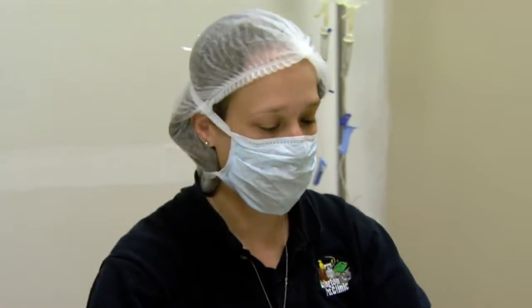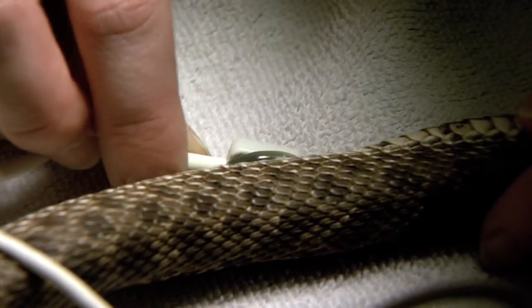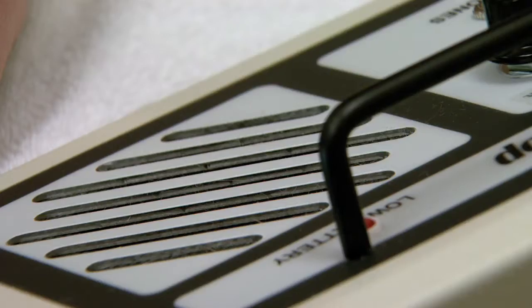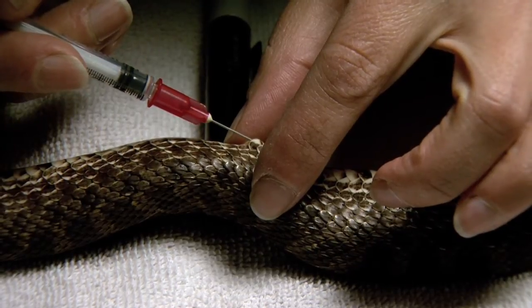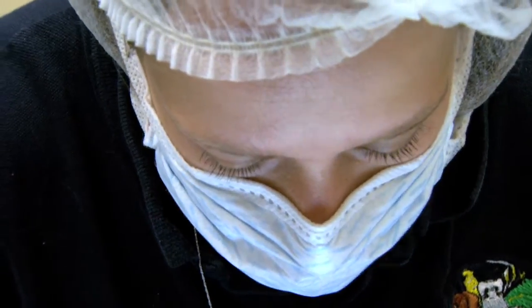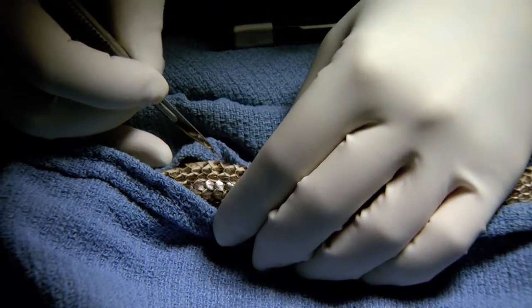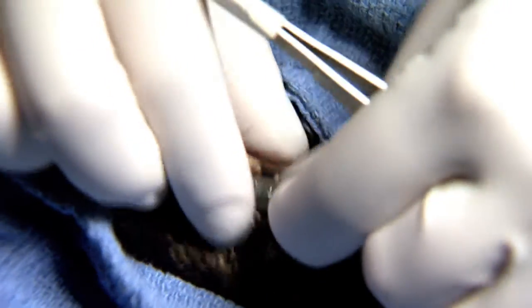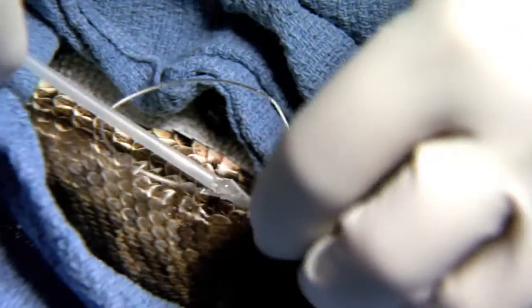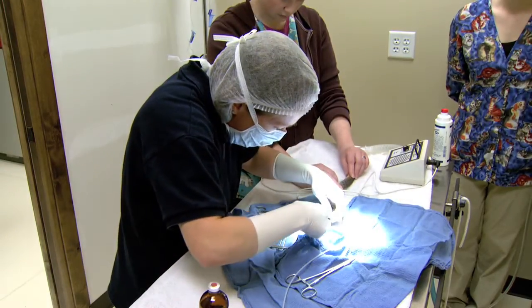I'm going to put a little bit in there and get a pulse with the Doppler. Then we'll put a little lidocaine where we're going to make the initial skin incision. Ready to make our incision — okay, I think we're good.